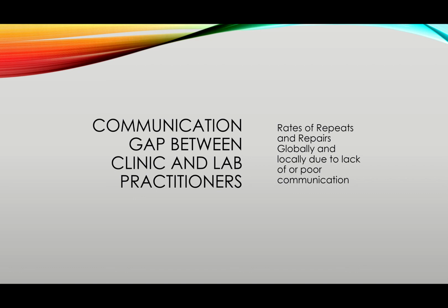And I really want you to think about the whole case as a whole. Think about strength, but never overlook aesthetics. Think about aesthetics, never overlook aging or low temperature degradation. Okay, choose lithium disilicate if you think that it's prettier, but think about the occlusal force. Why not use zirconia?